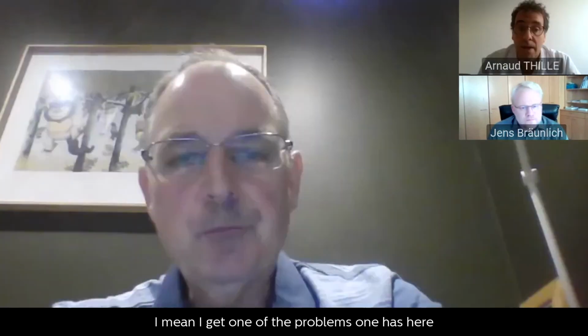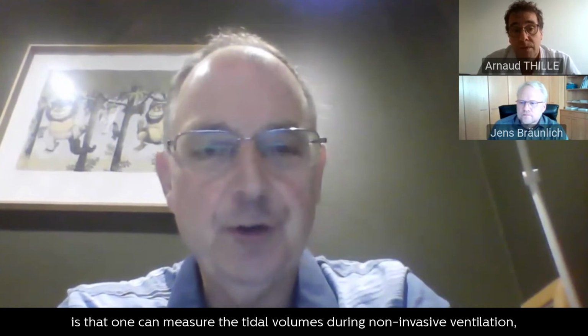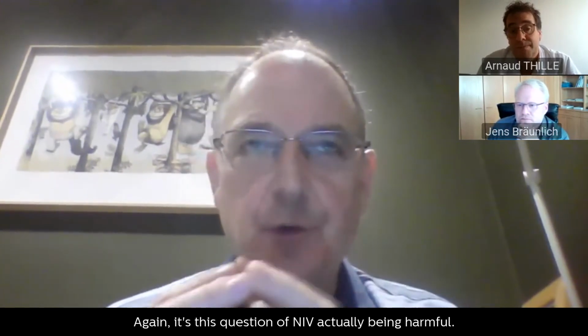I guess one of the problems that one has here is that one can measure the tidal volumes during non-invasive ventilation, but you can't measure the tidal volumes while the patient is receiving nasal high flow. Again, it's this question of NIV actually being harmful.